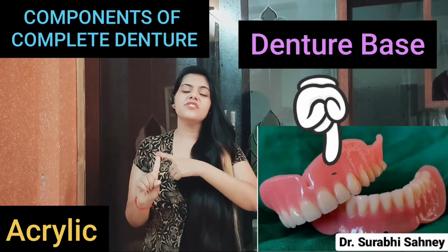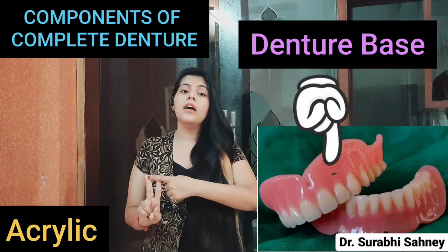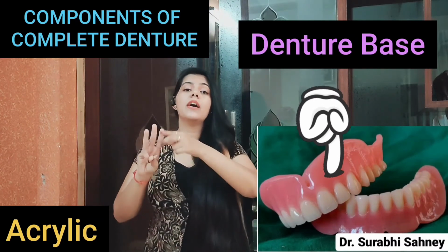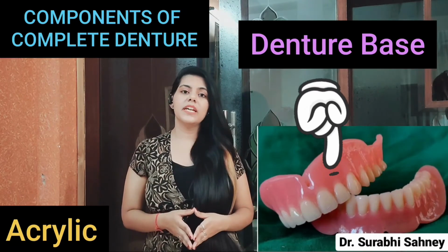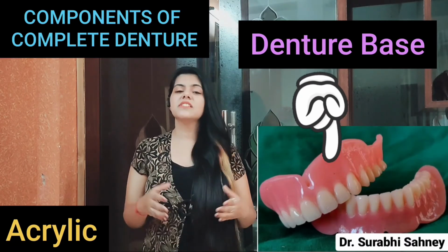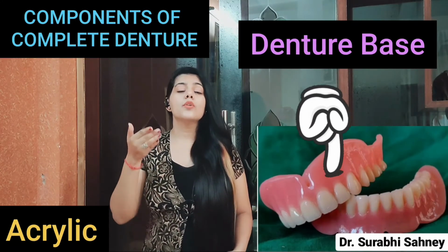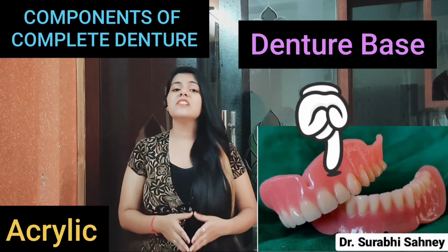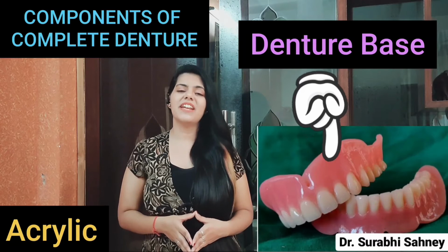Its first advantage is it is transparent, pink in color, resembling the gingiva, and it is easy to fabricate. Along with that, it will provide a good aesthetic quality or good aesthetics. Important point is you can easily reline or rebase as it is required in future. Next advantage is that it is strong enough to withstand the occlusal forces which occur during mastication also. And the last point is it is available in a variety of colors depending upon the characterization.